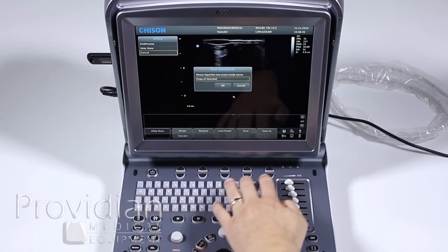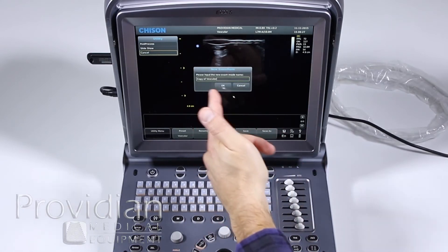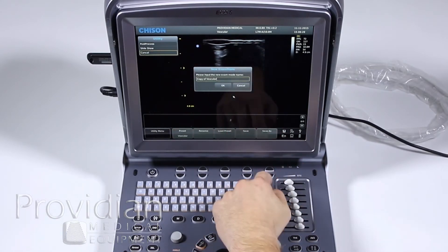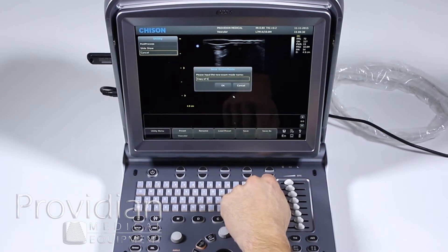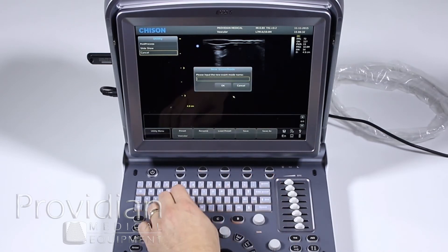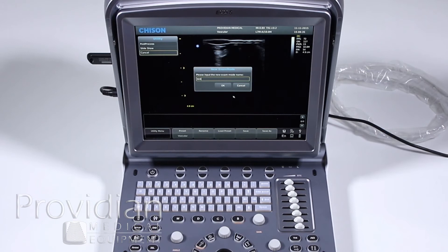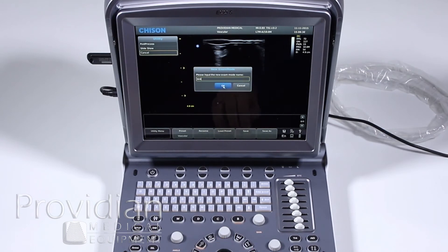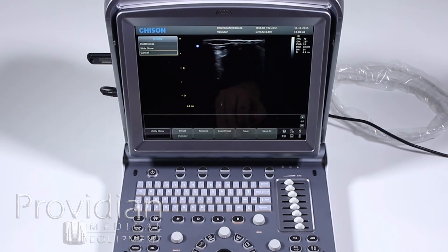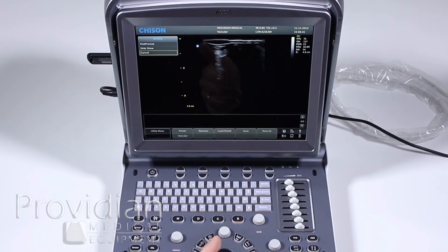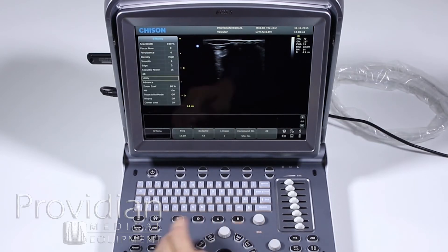And it's going to say, what do you want me to call this? It says copy of vascular. Instead I can just write test and click okay. And now I have my own preset named test. How do we know that?